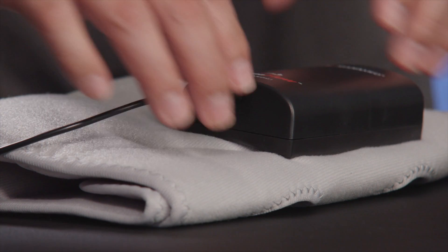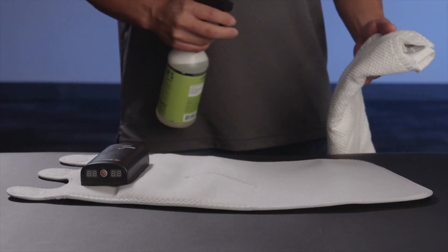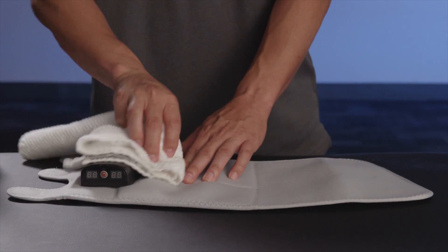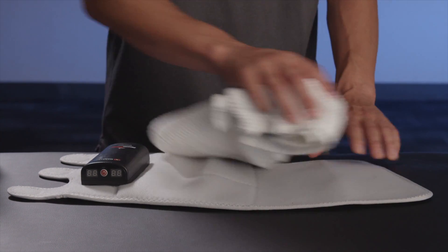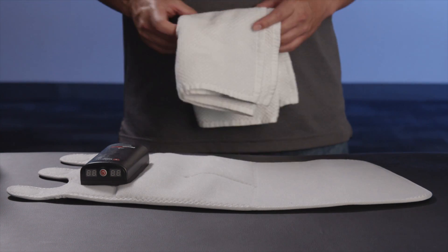The device must be turned off and disconnected from the wall outlet prior to and during cleaning. Do not immerse the device in any liquid for any reason. Do not place in autoclave. Clean the outer surface of the pump and the exterior of the cuffs using a soft cloth moistened with soapy water or 70% isopropyl alcohol. Air dry only. The unit must be completely dry prior to use.